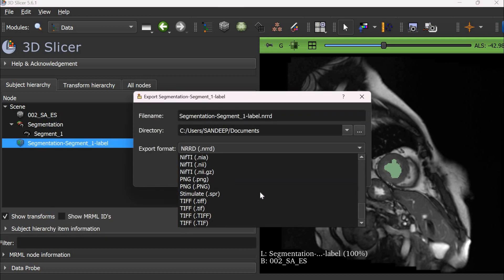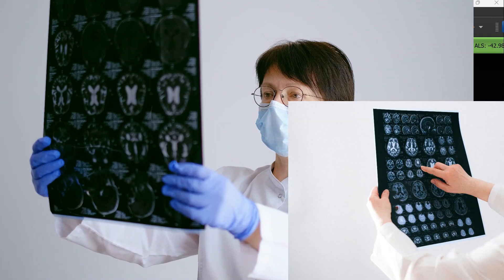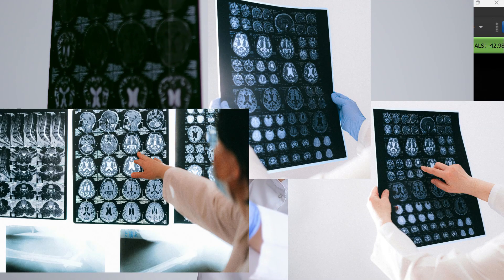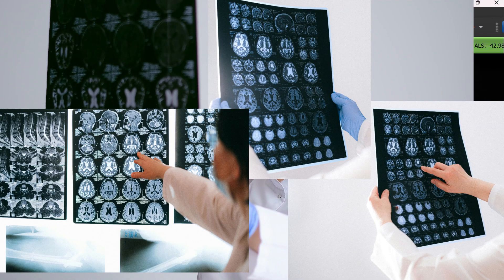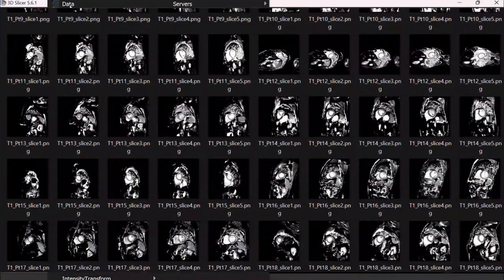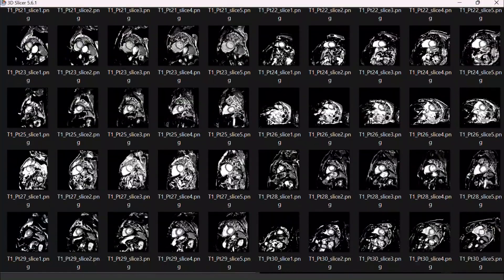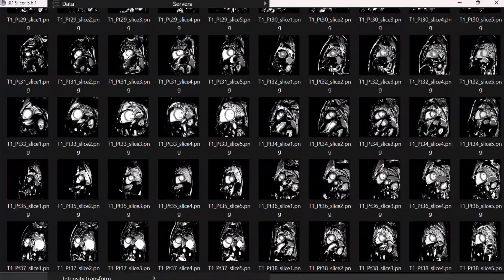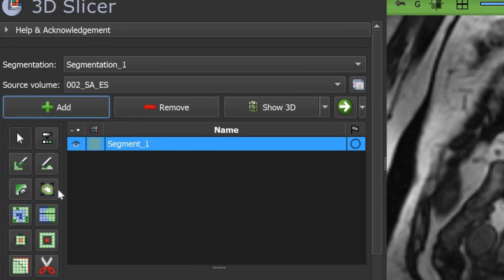So this is how you create a mask manually if you have less number of images. But if you have a huge stack of images, manually creating masks can be very tedious especially if you have thousands of patients data. In this case, level tracing is a very good option for creating masks quickly.